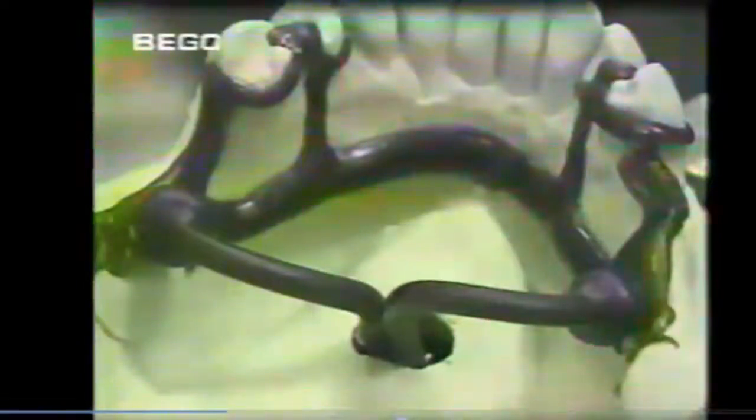This lower wax-up is cast through the model. If sprues with a diameter of only 3 mm are used, a reservoir is advantageous for the melt. This is a reliable way of avoiding shrinkage cavities at the sprue fixing points. The reservoir should be about 2 mm away from the wax-up.